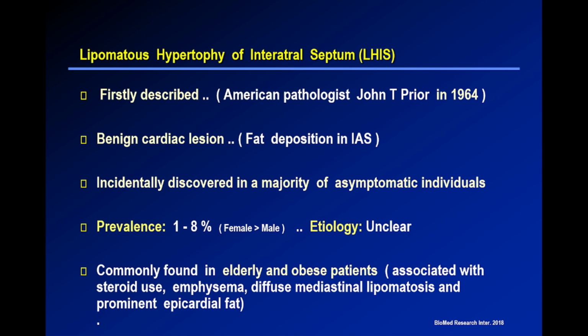The etiology is unclear, and it is commonly found in elderly and obese patients, associated with steroid use, emphysema, and diffuse fat deposition in other tissues like mediastinal or prominent epicardial fat.